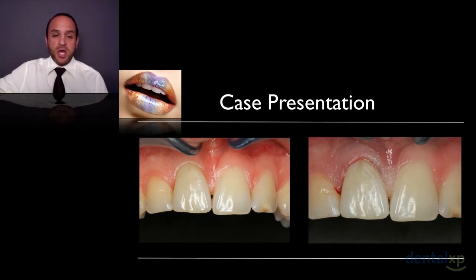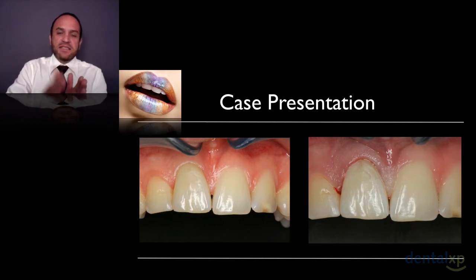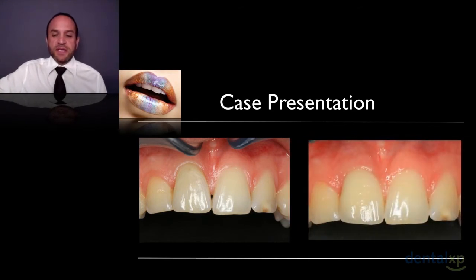What we actually did was we took the temporary off and we concaved the underlying part to allow the soft tissue to fall down, so that when we came to the final, you can actually see we had a better situation 1 to 1.5 years later. We were almost in the exact correct position of the gingiva in that case. So it's a very important thing and a way that I like to work, for the pure reason, and I'll explain a little bit later when we get to some further details at a later slide.